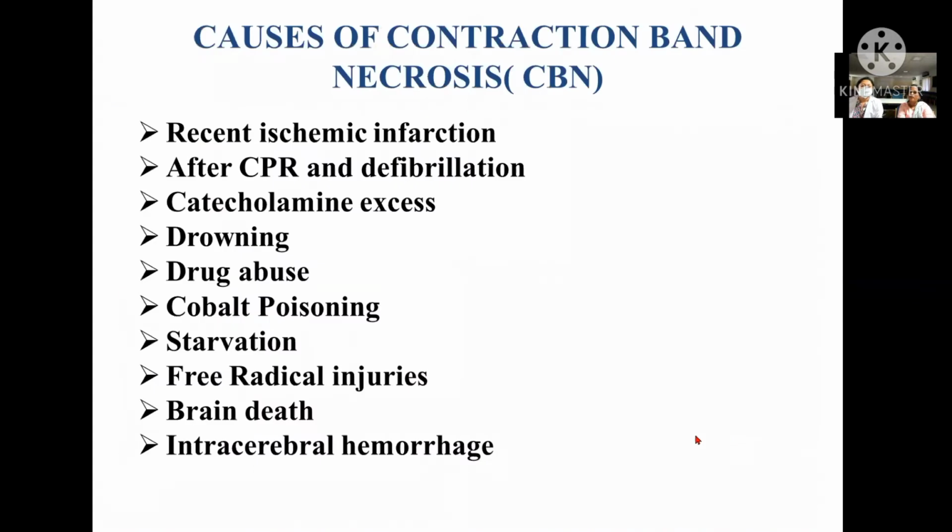And can we summarize the causes, whenever we see such contraction band necrosis? So what are all the possibilities? What does this microscopic feature tell us about? Recent ischemic infarction. It is actually the most common cause, they say. Yes. And then we can see such changes after CPR and defibrillation also. And also in the state of catecholamine excess, and in cases of drowning, drug abuse, cobalt poisoning, and also in starvation. Other causes of free radical injuries can also cause contraction band necrosis, and less common causes are brain death and intracerebral hemorrhage.